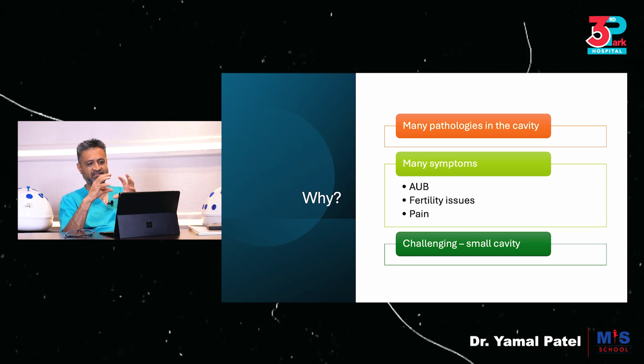It has a very small cavity to operate in, and this is a potential cavity that needs to be distended with some distending media to actually operate in it. So it's not like laparoscopy, where this is a whole big cavity for us. It's a small place, so it is quite challenging.